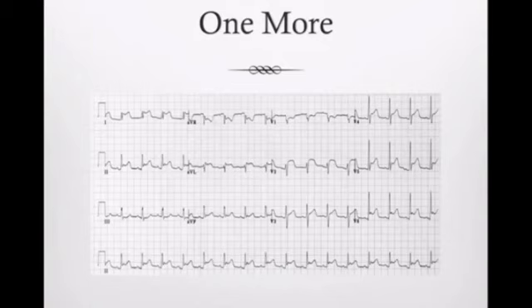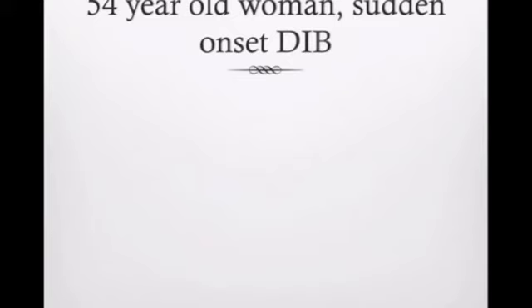So we always have to be wary of these diagnoses in the field. All right? So look at AVR for pericarditis. It can help us out. Right? That's why it's important. All right? Let's look at this one.